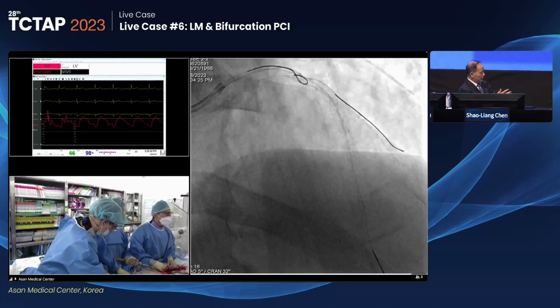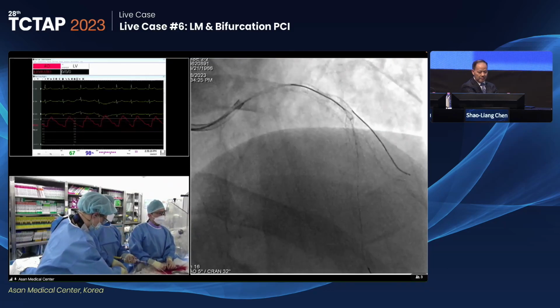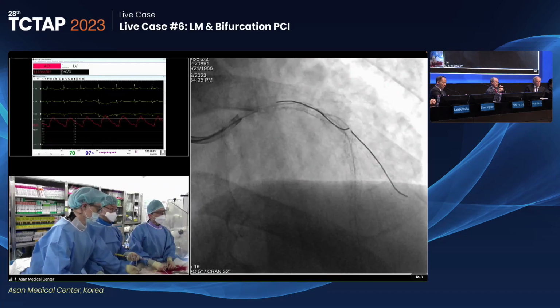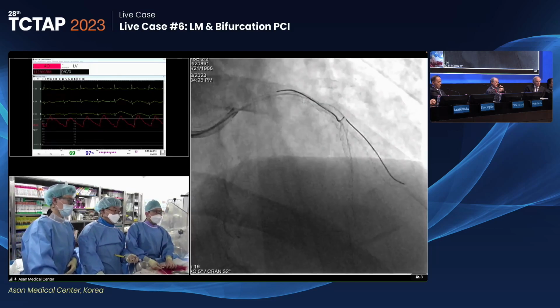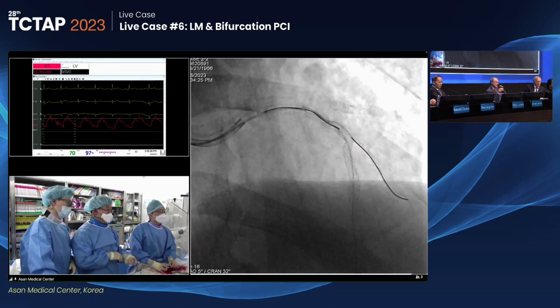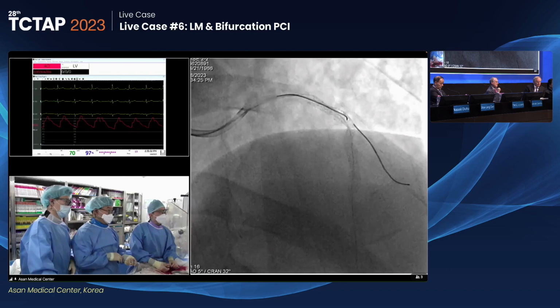So, Dr. Colombo, can we switch to the previous case? Yes. Can we? Okay. Yeah, that's a good point. Can we go back to case 1 to see what happened so far? They had to rewire the diagonal. Is that possible? Okay, please.